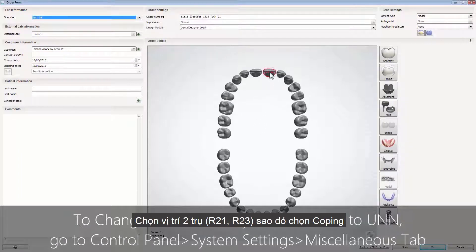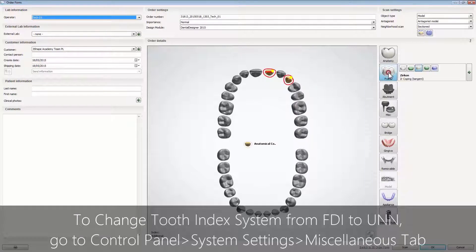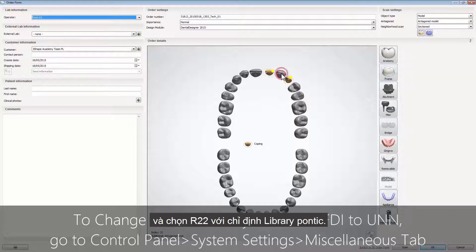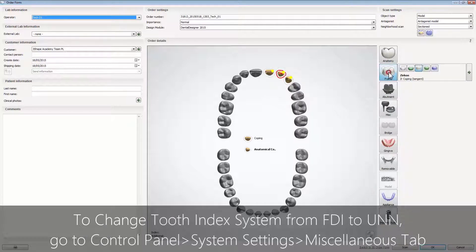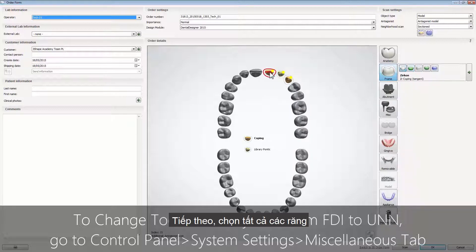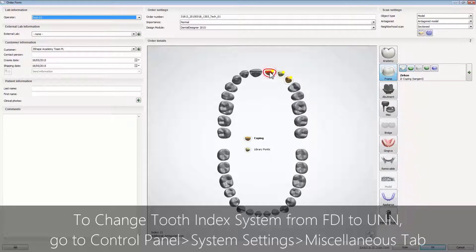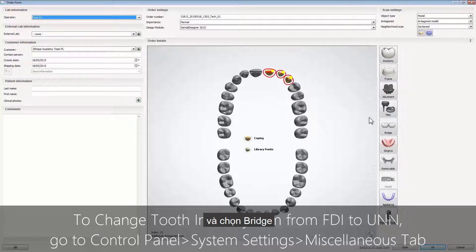For teeth 21 and 23 we are choosing single coping, and for 22 library pontic. Next, select all teeth and choose bridge.